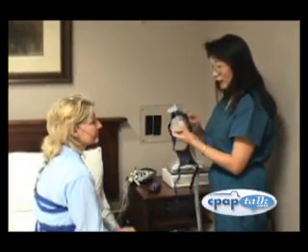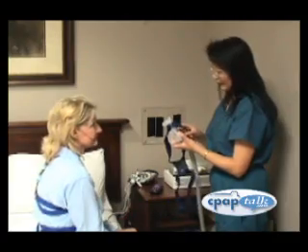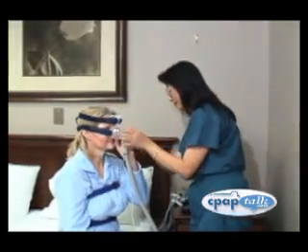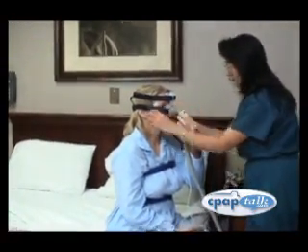The most preferred treatment for moderate or severe obstructive sleep apnea is continuous positive airway pressure, or CPAP. CPAP applies a light air pressure through the nose or mouth. This pressure is enough to keep the airway open so the patient can breathe normally while sleeping. Your technician may show you this equipment and adjust it to fit you before it is time to sleep.